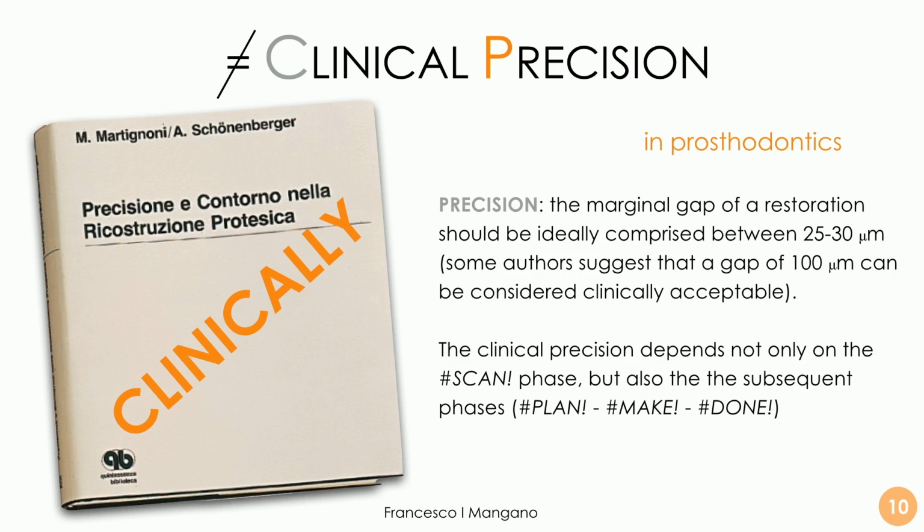Anyway, we need to be very clear when we talk about intraoral scanners and we talk about precision, accuracy, and trueness. We are not talking about the final clinical precision of our restoration, because in prosthodontics this term, clinical precision, refers to the whole workflow. I mean, the marginal gap of a restoration. This marginal gap should ideally be between 25 and 30 micrometers. Some authors also go up to 100 micrometers.